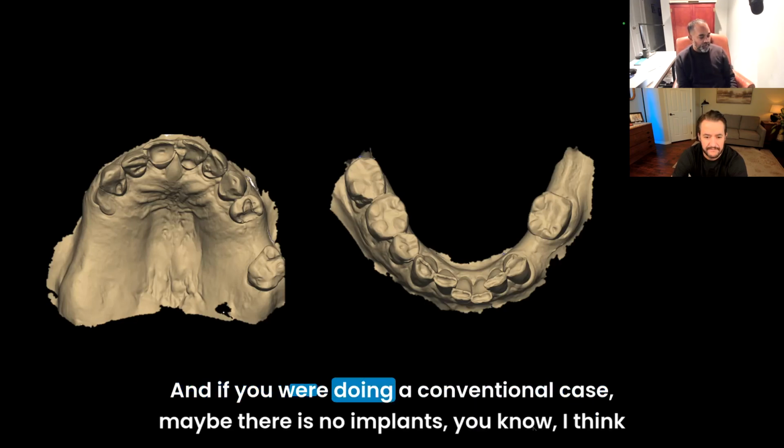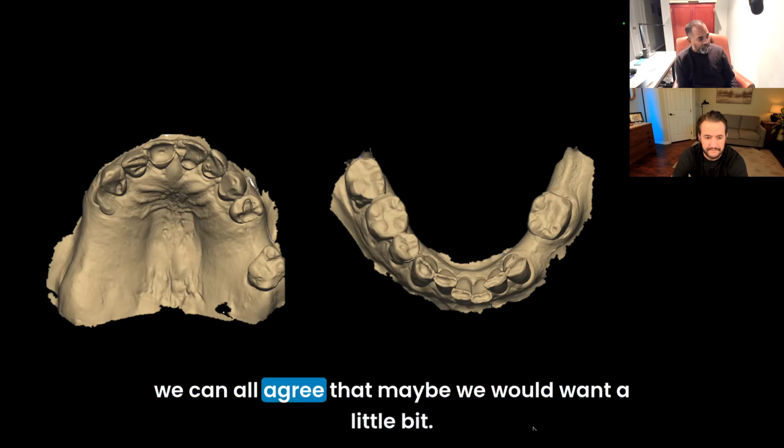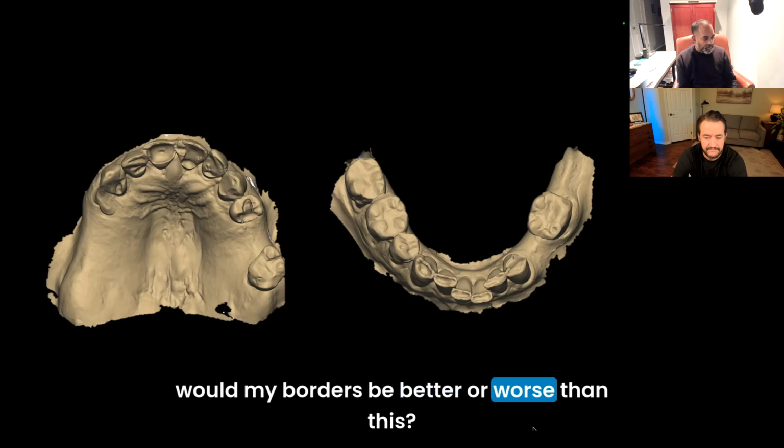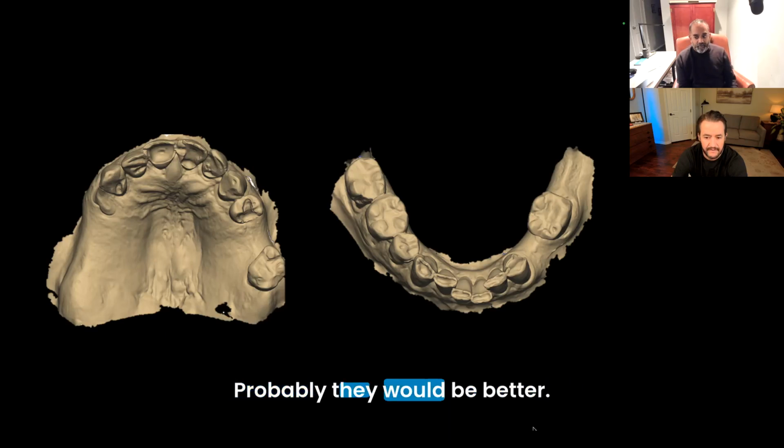And if you were doing a conventional case, maybe there were no implants, I think we can all agree that maybe we would want a little bit more border extension. Or maybe a better way to say it is, if I took a physical impression, would my borders be better or worse than this? Probably they would be better.